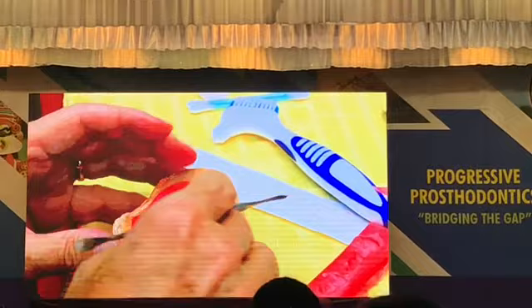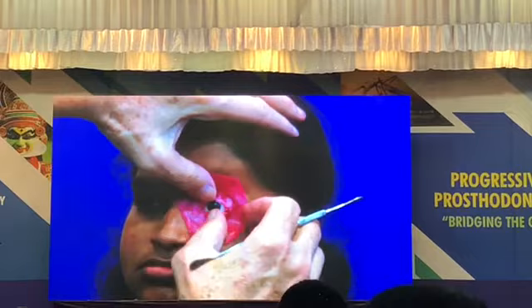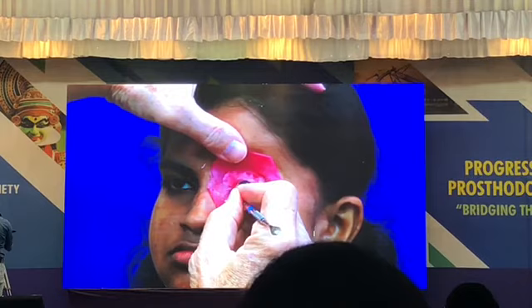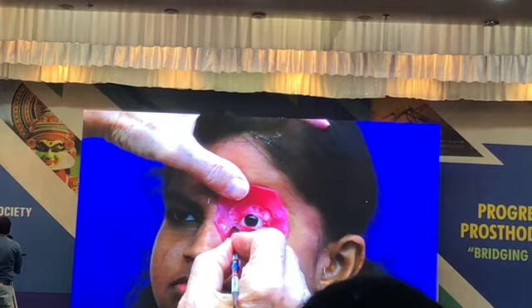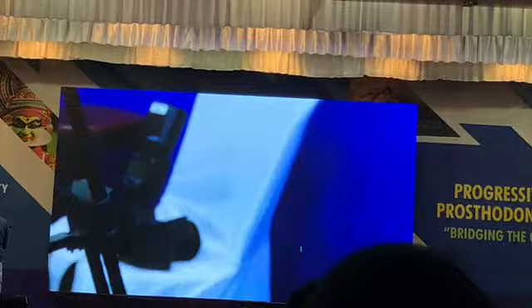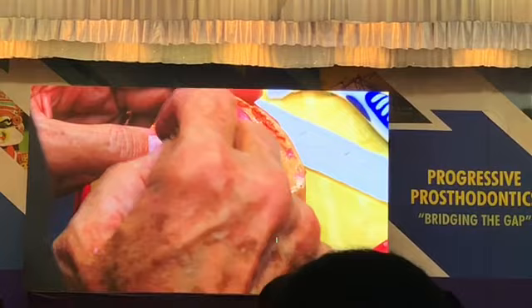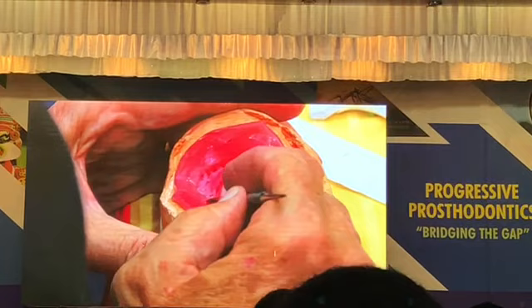The way they develop the lid contours, let me show you that, that's a very good one, is to first develop the position of the medial canthus and the lateral canthus. So you look, you say, where's the medial canthus? Well, it's supposed to be right there. You had it a little bit too low to begin with. And then the lateral is about right there. So once you have the medial and lateral canthus, then you can start with the lid contours. We'll do the lid contours here in a little bit, and then I'll show you a sculpting that we worked on yesterday, because we worked on a lot of the suborbital and superorbital contours.